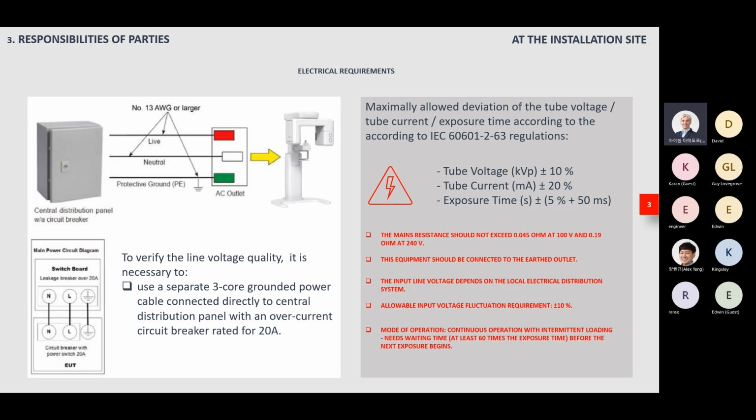So it's very important: the device should be earthed, or grounding, whatever you use in your country. So this part is very important. You might already know that. Otherwise, the electrical requirements are the same for most of the VATECH products.